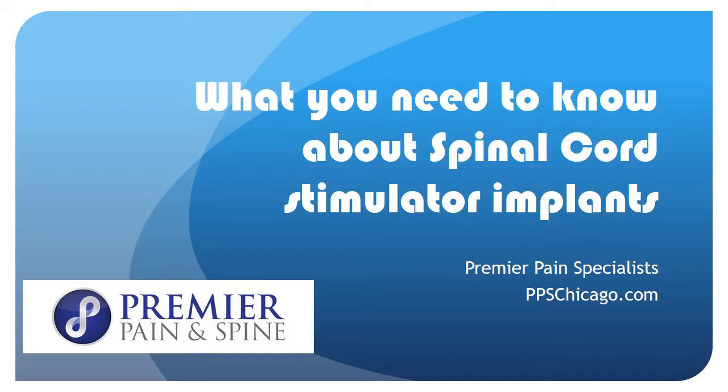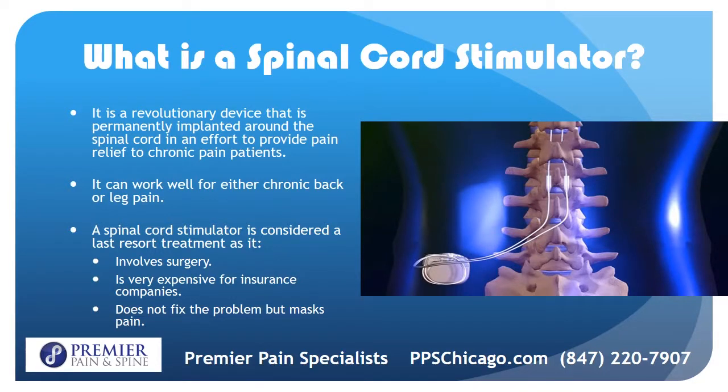Today's topic is what you need to know about spinal cord stimulator implants. Well, first of all, what is a spinal cord stimulator? It has truly been a revolutionary device that is permanently implanted around the spinal cord in an effort to provide pain relief to chronic pain patients. It can work well for either chronic back or leg pain, and actually even neck or arm pain with the latest models. It's considered a last resort treatment as it does involve a slight surgery.